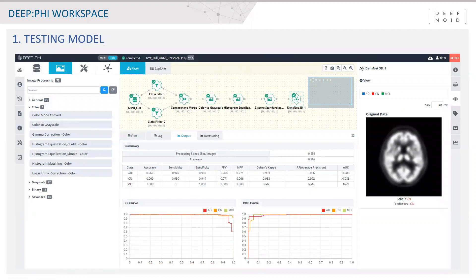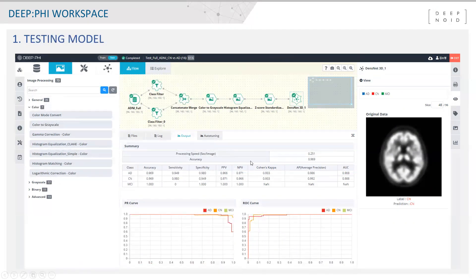Along with the learning process, the test layer can switch by clicking this step. The model works with the testing process, learning from test data assigned as 10% of the total dataset. These images show the prediction result of normal images with a prediction label. On the output tab, statistics show the same quantification method plus AUC, AP, and Cohen's kappa coefficient between testing results and training results.